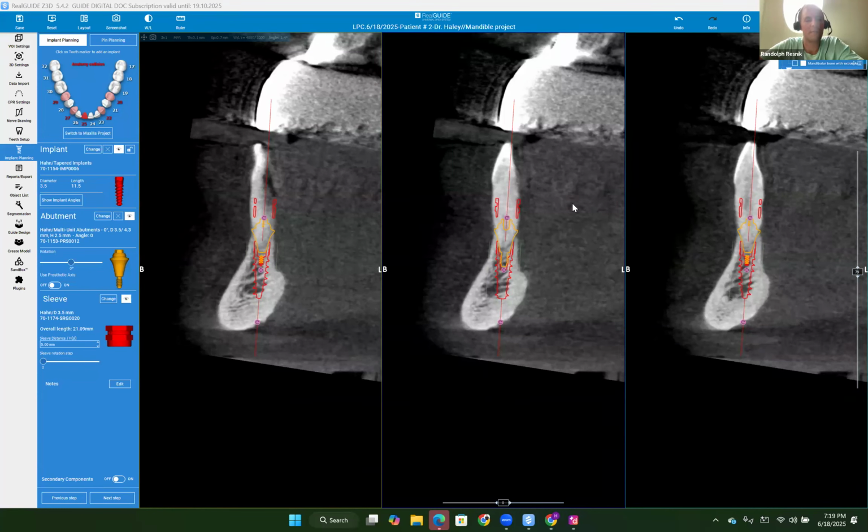So you would fixate the foundation guide, then take the teeth out, do the alveoplasty, and then put on an implant guide and do your implant drilling. Once the implants are in, you would have a PMMA that already has the holes cut out that would go into the foundation guide. That would probably be the smoothest and quickest way to do this case, but definitely you're going to have to talk with him about whether he is able to tolerate a 2 hour procedure with the drilling and all that. You could talk about IV sedation or oral sedation if that's something you do in your practice, to see if he's able to tolerate it.